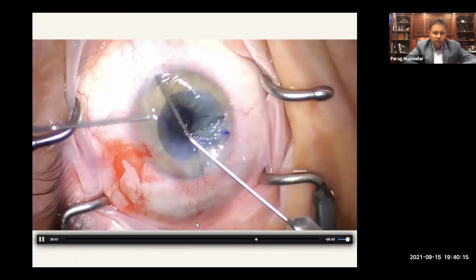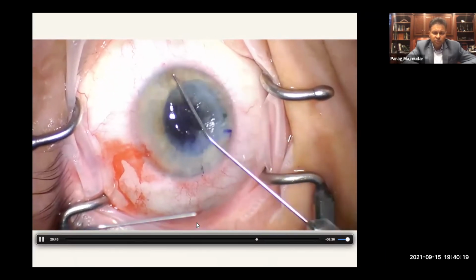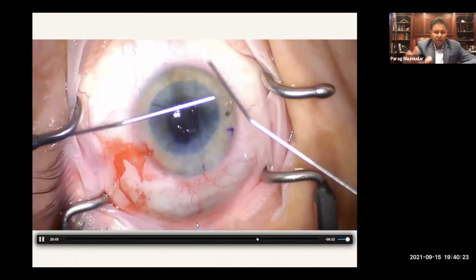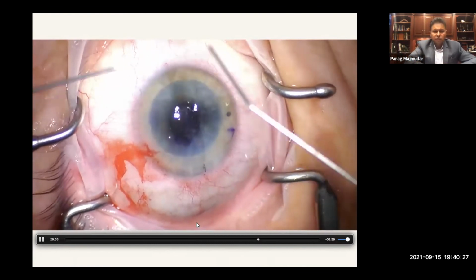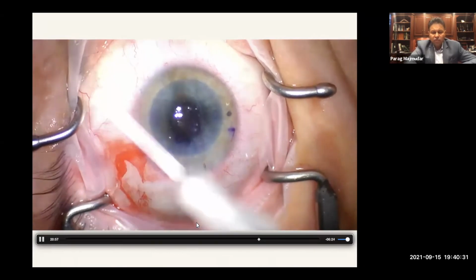Obviously, nothing's intraocular. And so now here I find that, in all this maneuver, my graft got decentered a little bit. So you can use some tapping maneuvers. Again, all you're using is the fluidics inside the eye, the current of the aqueous to push things where it needs to be. And I'm pretty happy with that configuration there.